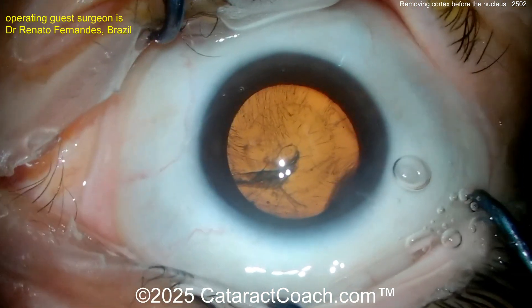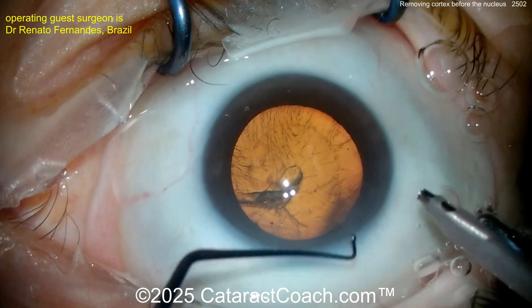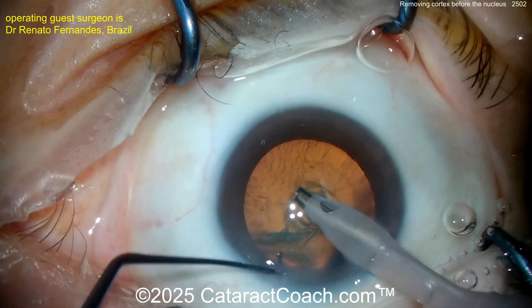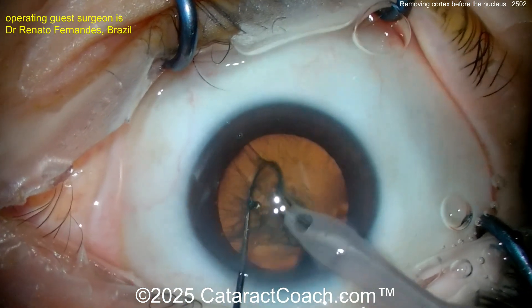This technique is called primary cortical aspiration — doing the cortical aspiration first. I've never done this but I'm interested to learn; it looks like a pretty novel technique. Now going in, right up against the rhexis.